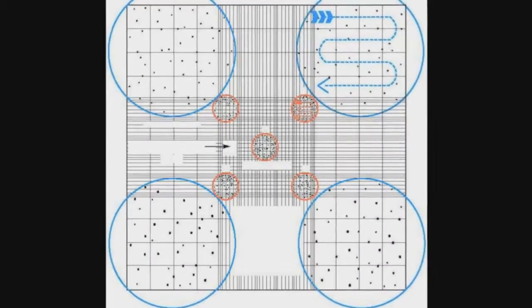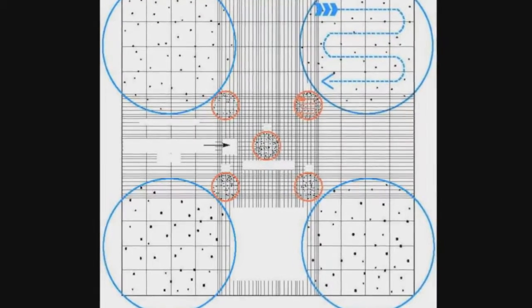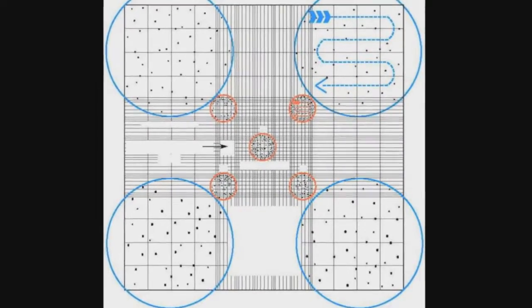Calculation. For RBC counting, the central square of the counting chamber is considered. The cells present in the small squares of the central square are counted. For WBC counting, the corner 4 squares are taken.